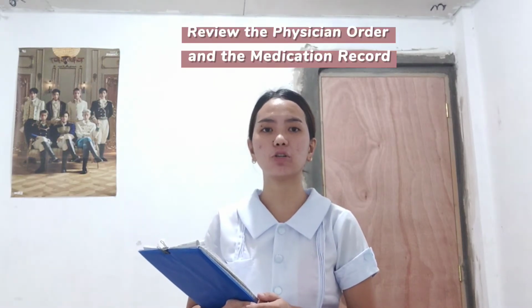First, we're going to review the physician order and medication record for the medication to be given. So we will review the medication record and the physician order. Next, I will determine the materials that are needed. I need a syringe and vial, the cotton swab, and the gloves that we'll use.